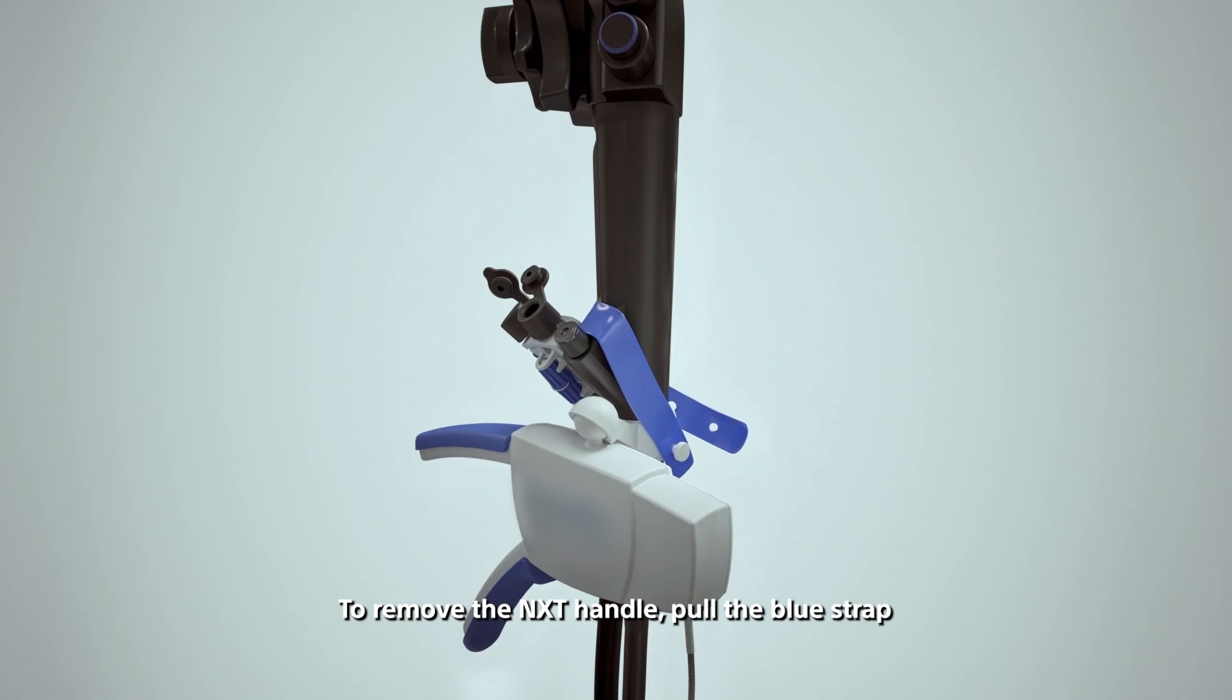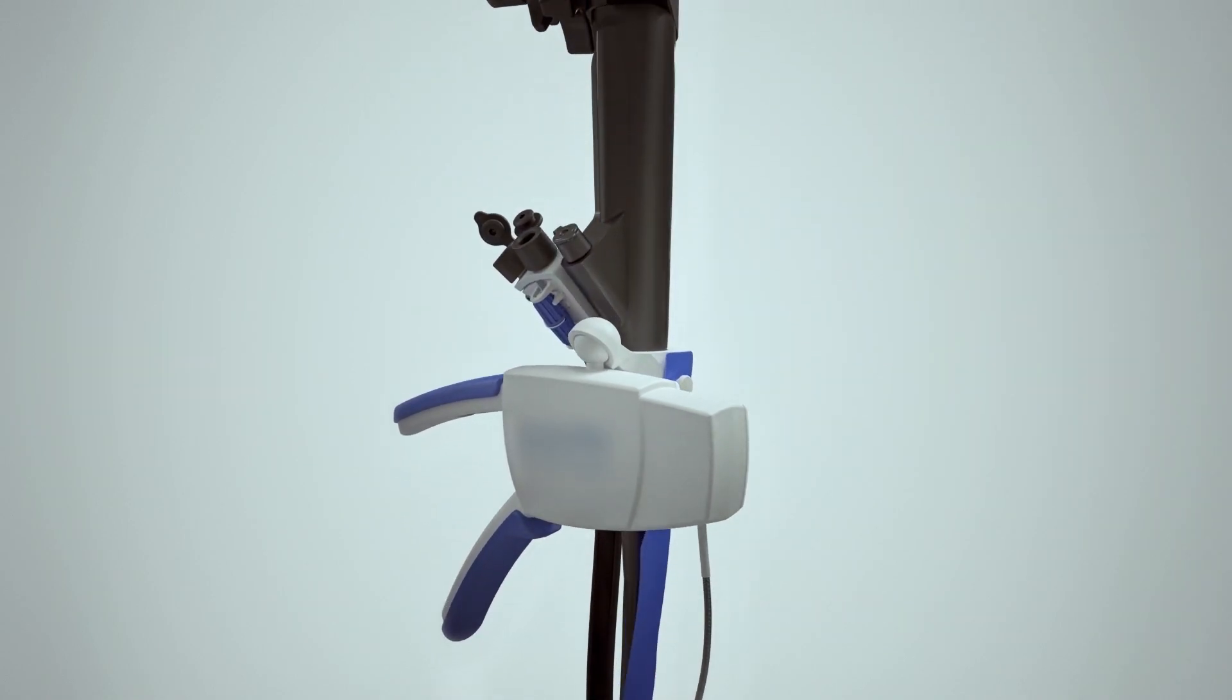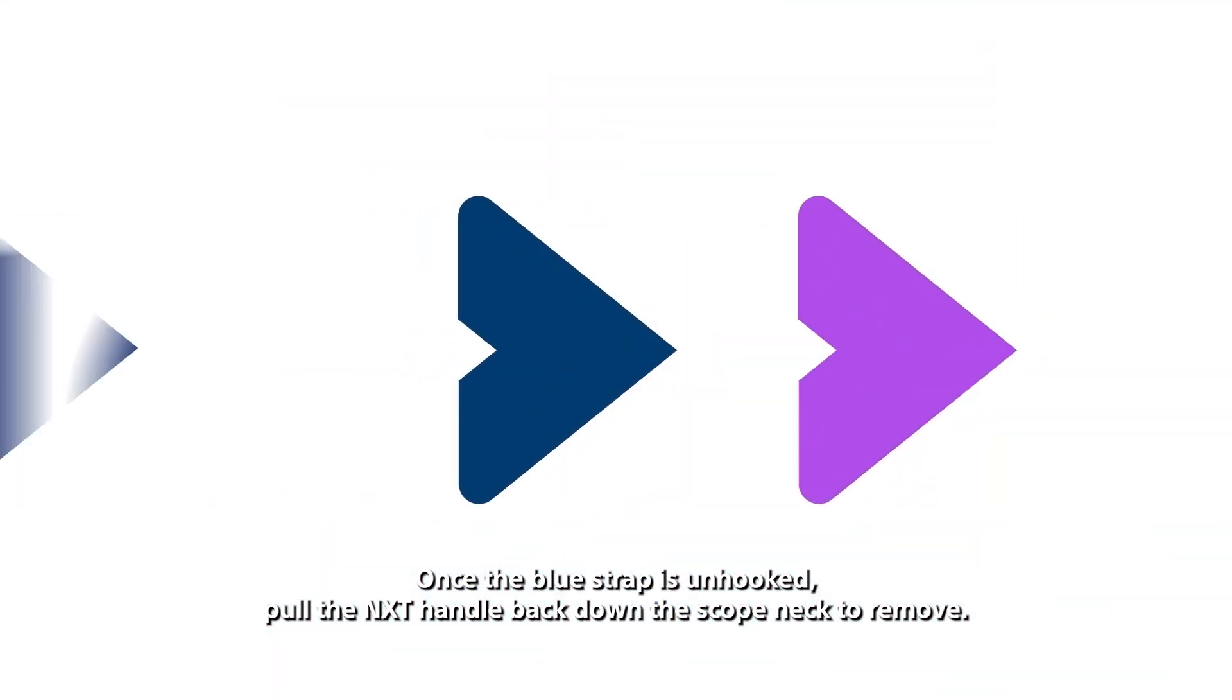To remove the NXT handle, pull the blue strap away from the scope to release and unwind from the scope. Once the blue strap is unhooked, pull the NXT handle back down the scope neck to remove.